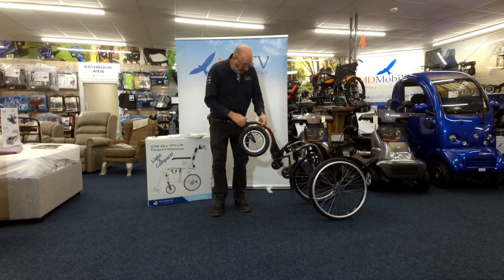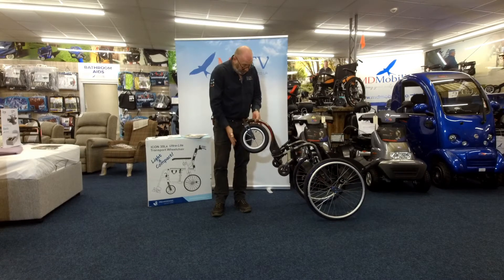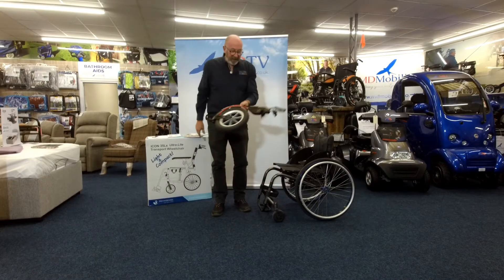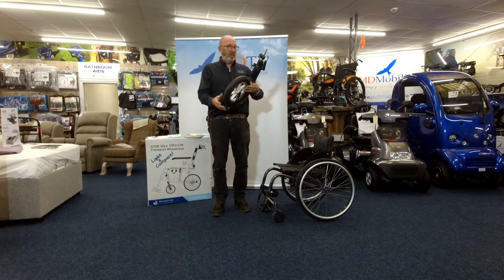So anyway, ReaSense have brought out this — it's carbon fibre, it's absolutely superb, it's lightweight, very strong, very robust. The nice thing about it is that it goes underneath here, and as you can see it literally takes two seconds to put on or take off. It's beautifully, beautifully made.